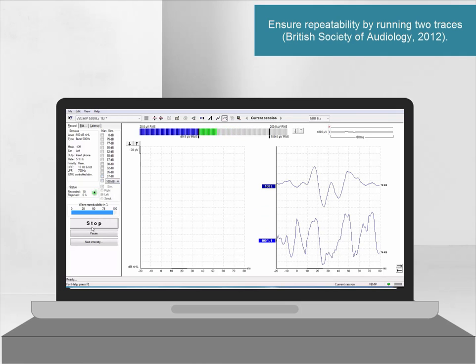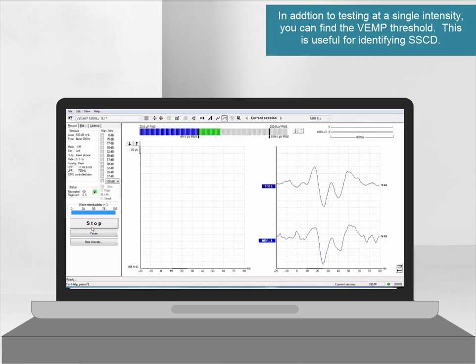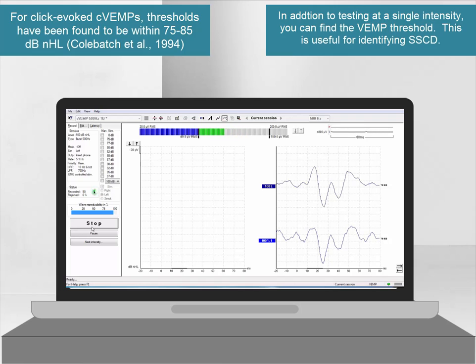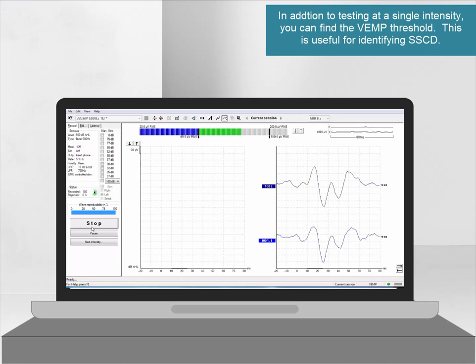For superior semicircular canal dehiscence testing, the Vemp threshold must be detected. A normal functioning saccule typically displays a threshold of around 80 dB NHL.